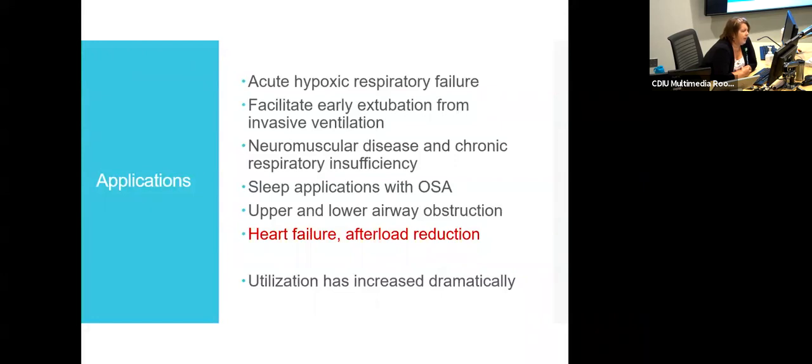The original application for non-invasive support is with obstructive sleep apnea, and that transcends from the adult population, which means that a lot of the devices and the interfaces are designed for adults.